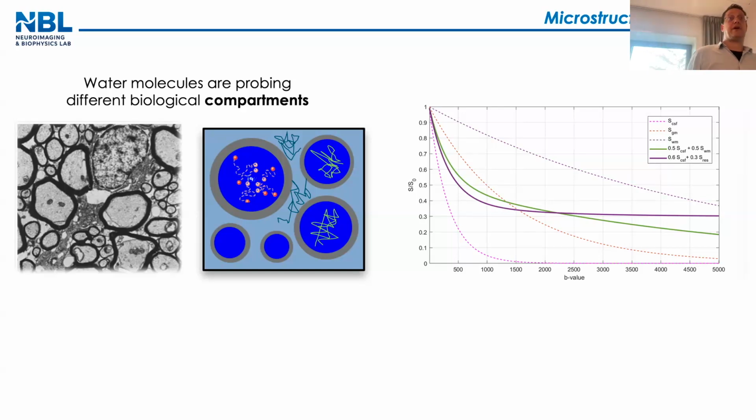And then you have extracellular diffusion. And then you have, I don't know, macroglial diffusion. Then you have astrocyte diffusion. Then you have so many things around. So different components can contribute in different ways. If, for example, we just assume two compartments, you see that the attenuation clearly deviates from a normal exponential. So a single measure, a single b-value, cannot tell you which model you have.